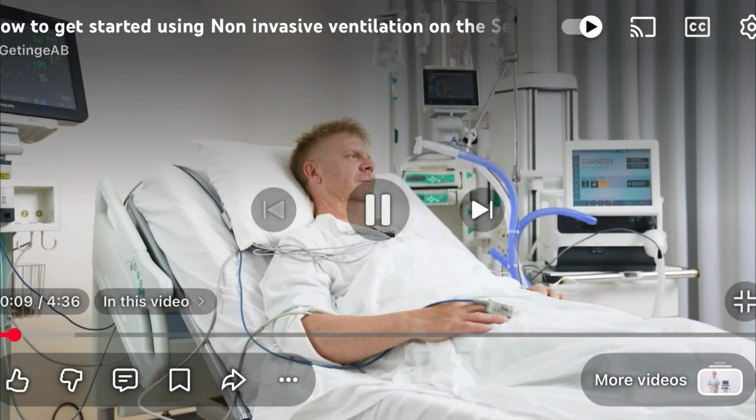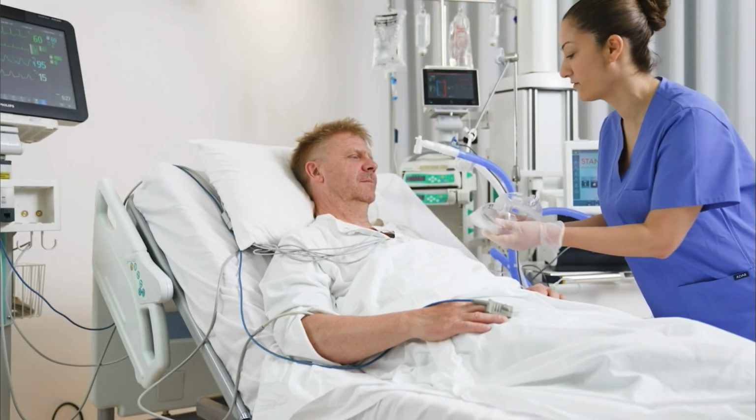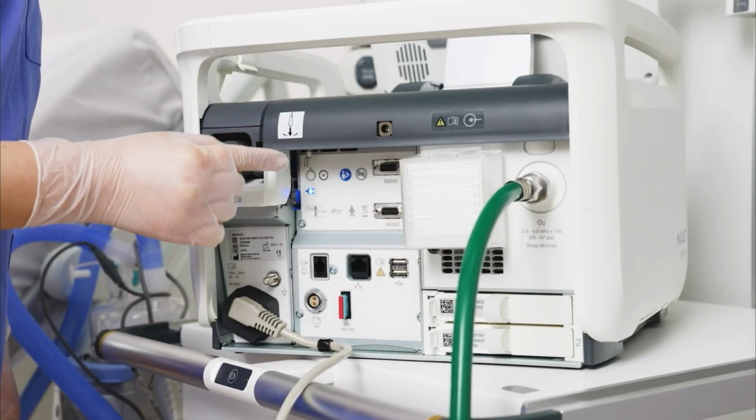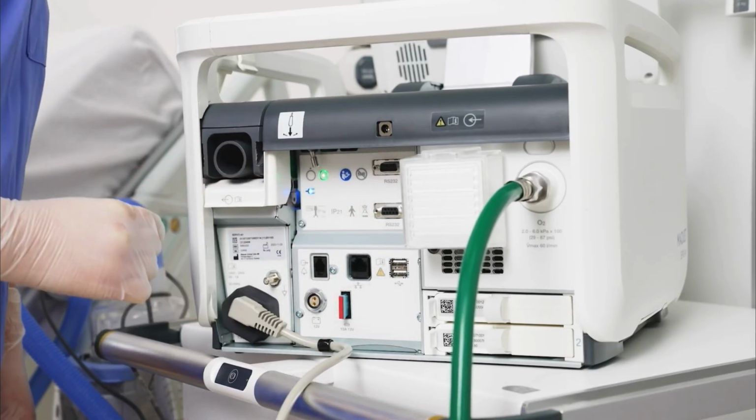This is how to get started using non-invasive ventilation on the Servo Air ventilator. Plug in the power cord, connect the oxygen hose, and switch on the ventilator here by pulling down and moving over.